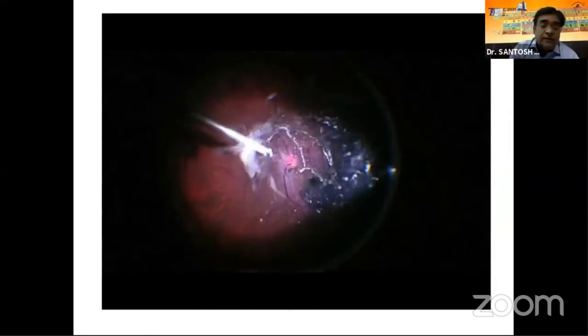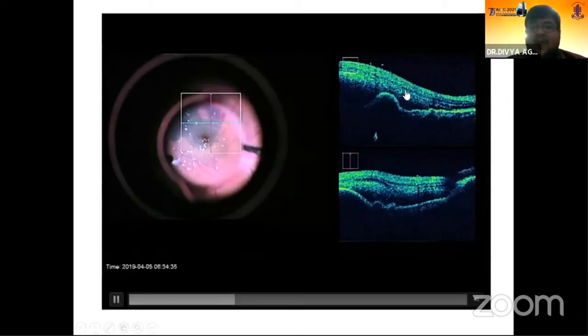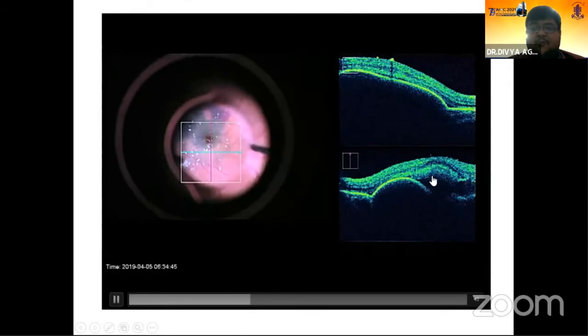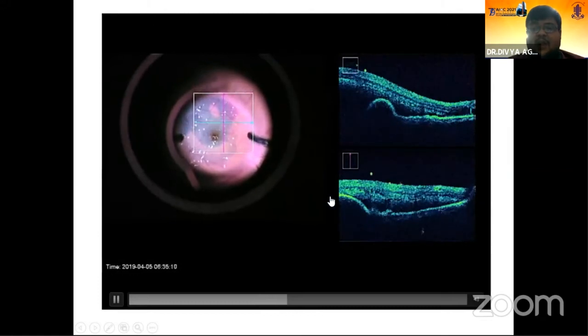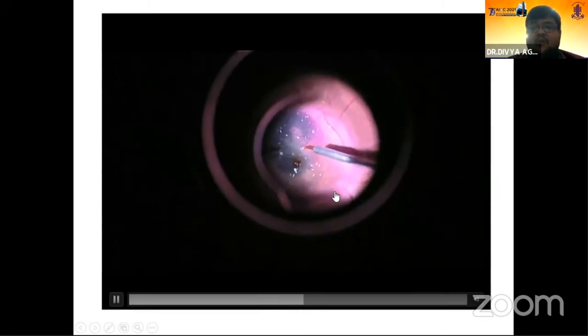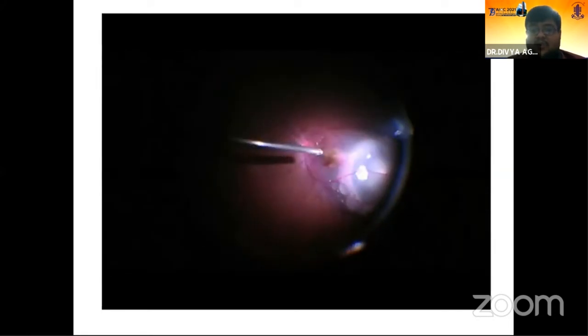Pars plana vitrectomy was done, PVD was induced using triamcinolone. With the help of intraoperative OCT, we can easily distinguish areas of bleed with the highest height, as well as areas of pigment epithelial detachment which are sometimes difficult to see. We then injected the cocktail, and at the last you can see air also going subretinally.